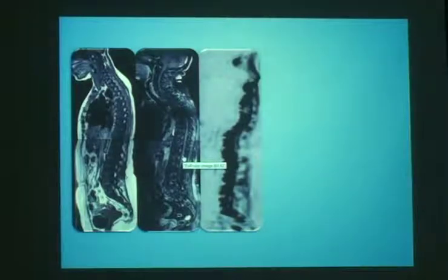As for her MRI, now this is one of the cases where MRI wasn't beneficial, because as we can see, there's a diffuse hypointense signal of the marrow, and then there's the diffuse mottling of the marrow on the STIR sequence, and this is her diffusion study. Now, we can't point out a lesion, and the whole marrow is involved.